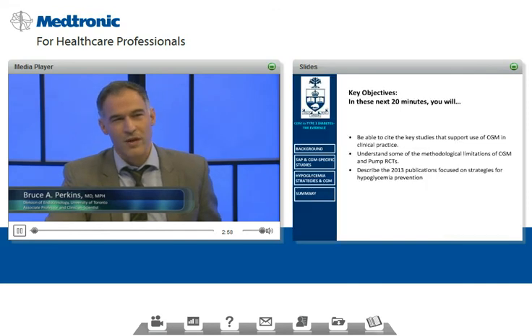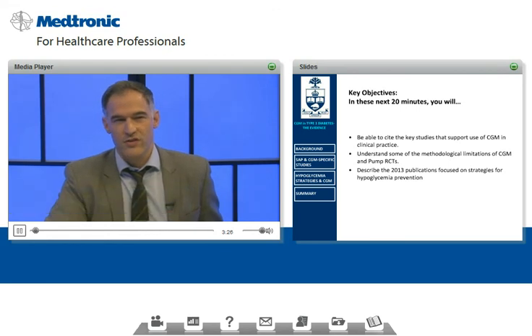So just to expand on that objective of reviewing the objectives, I'd hope that in these next 20 minutes or so, you'd be able to cite the key studies that support CGM in clinical practice, understand some of the methodological limitations in the randomized control trials of this area, and describe these recent 2013 publications that are focused specifically on hypoglycemia prevention strategies using the technology.